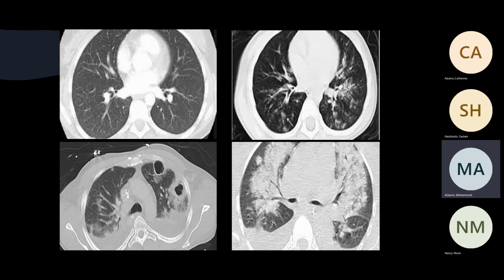Like functional residual capacity. It's not, is that right? Can you calculate it by just looking at the CAT scan? Nowadays, there is a machine that can do that for you, but with just looking at the CAT scan, you cannot know the FRC, is that right?